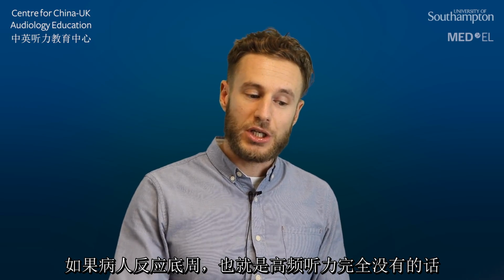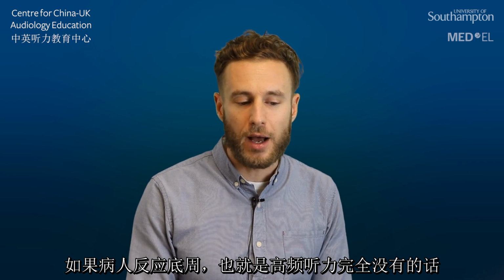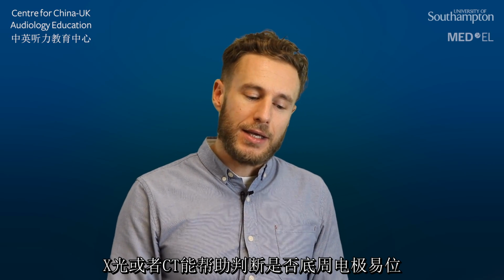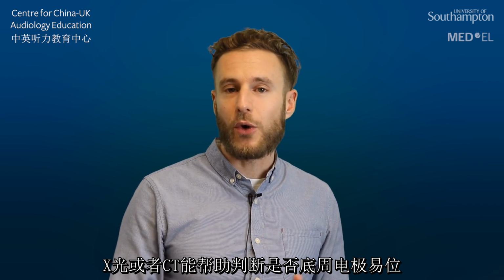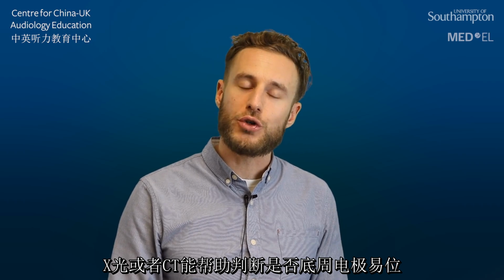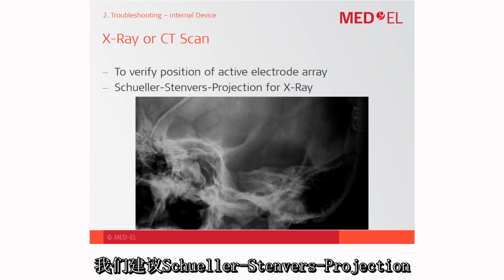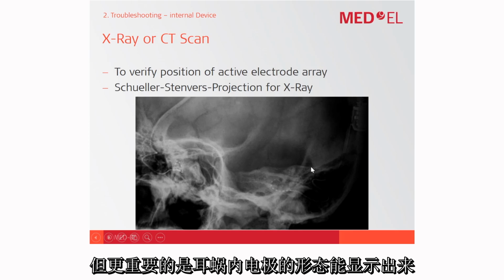If a patient reports no auditory perception on basal channels especially, then an X-ray or a CT scan could be helpful to assess if the electrode migrated out of its initial position. So here we suggest a Schüler or Stenvers projection, but I think it's important that this characteristic shape of the electrode inside the cochlea is nicely shown.